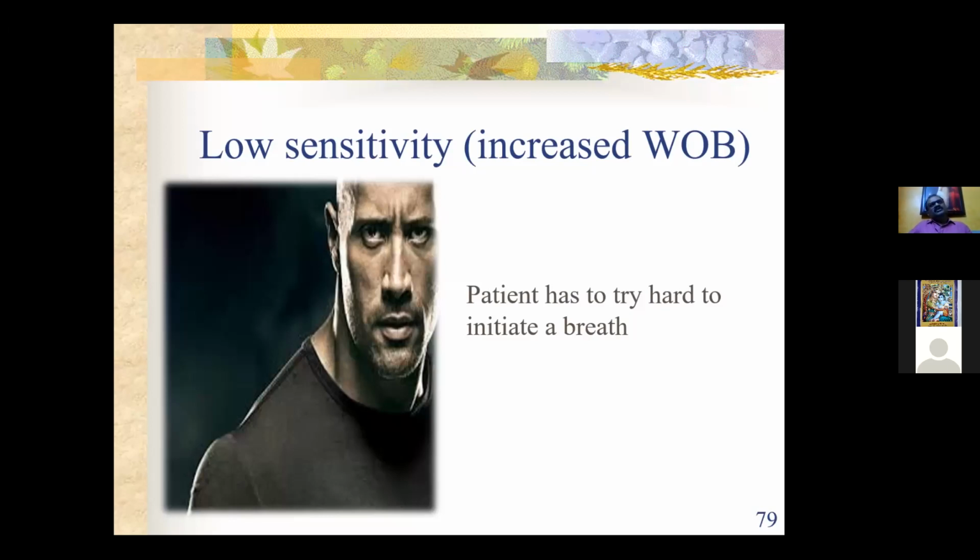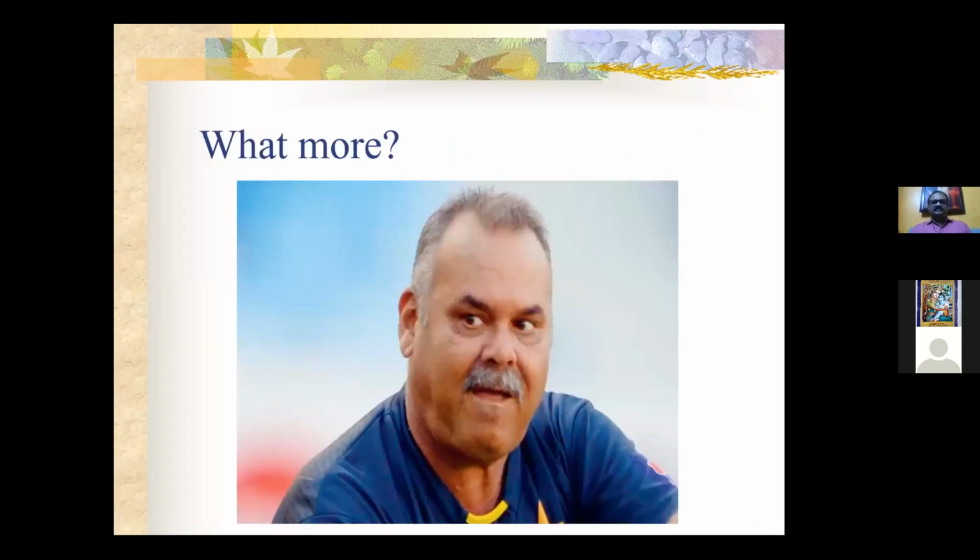And when you set a low trigger, the sensitivity will be very high. So in some machines, you directly set the trigger value. In some machines, you set the sensitivity. So depending upon that, you have to make sure which you are setting. Low trigger means there will be high sensitivity. High trigger means there will be low sensitivity. So you have to find out what you are setting.